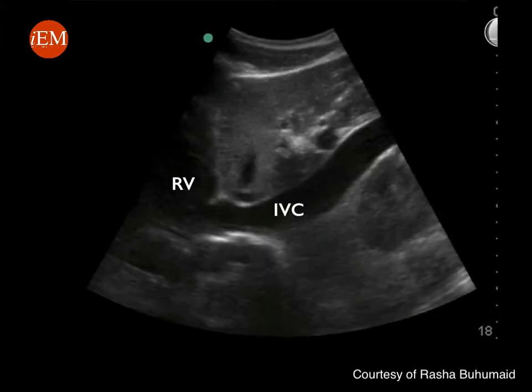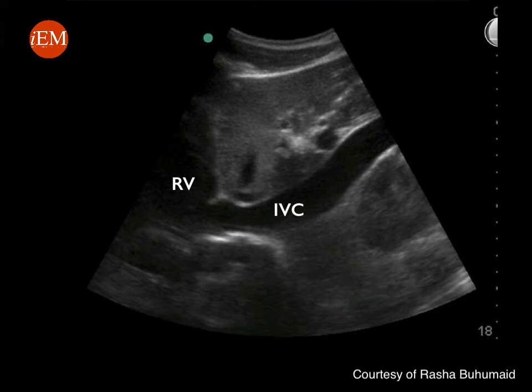This is the corresponding ultrasound image. The IVC is a tubular structure that drains into the right atrium. It's extremely important to visualize the IVC going into the right atrium in order not to confuse it with other structures, for example the abdominal aorta.